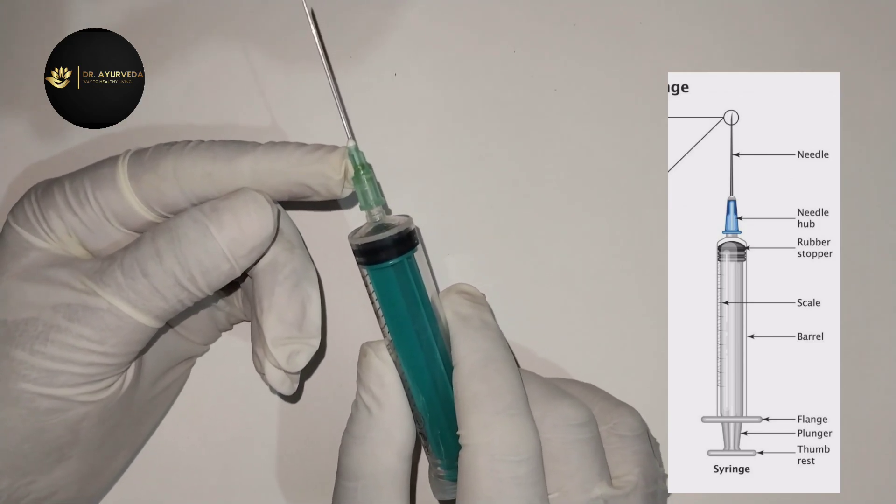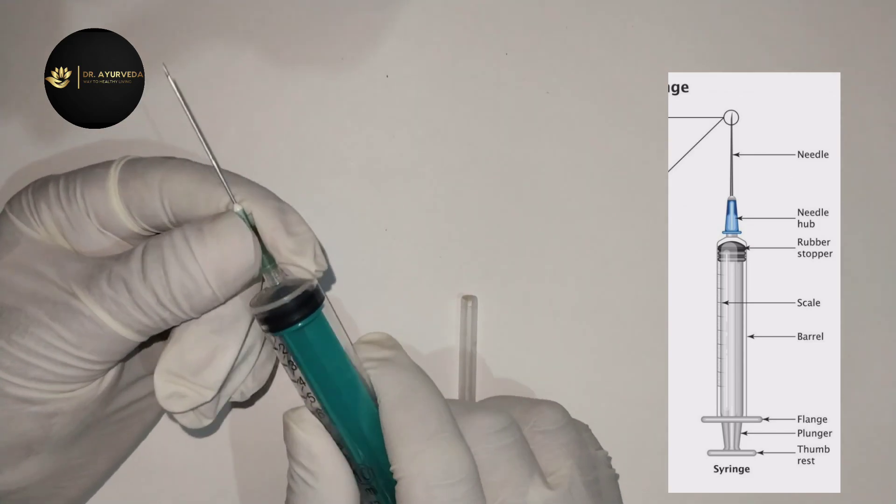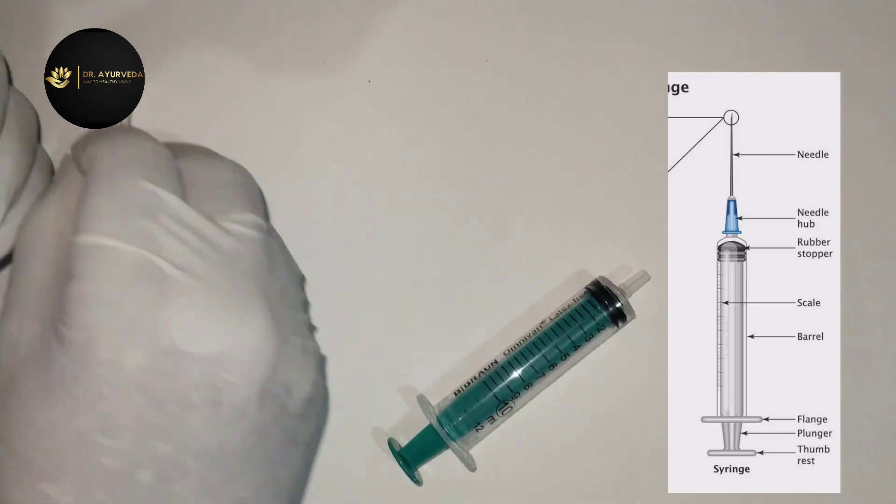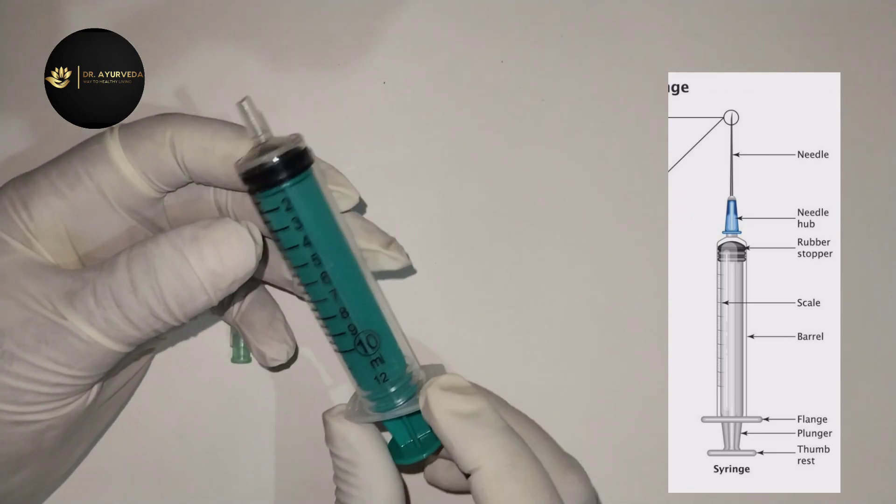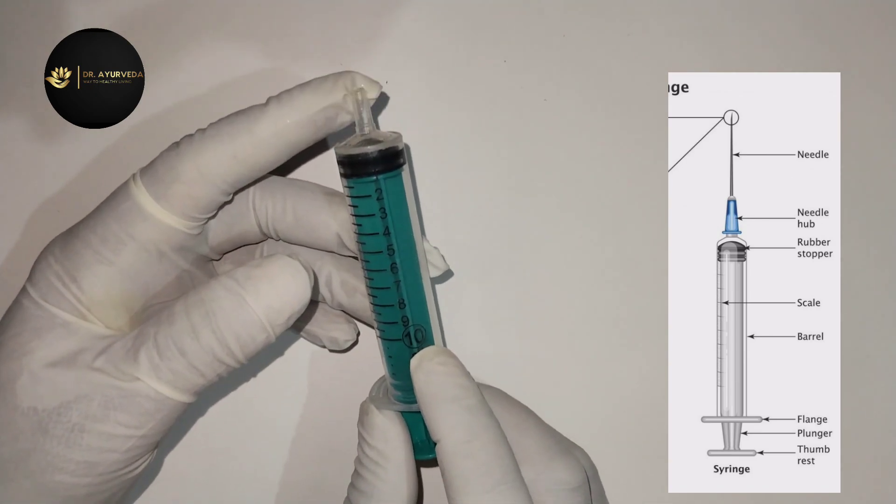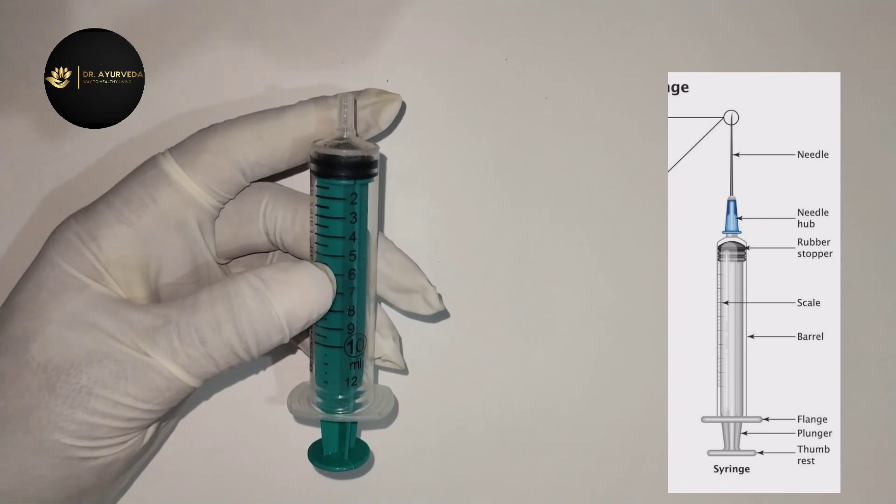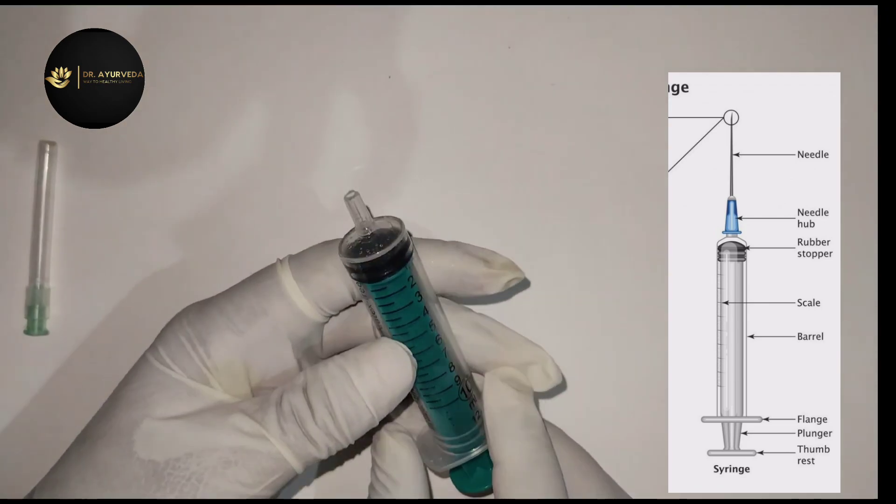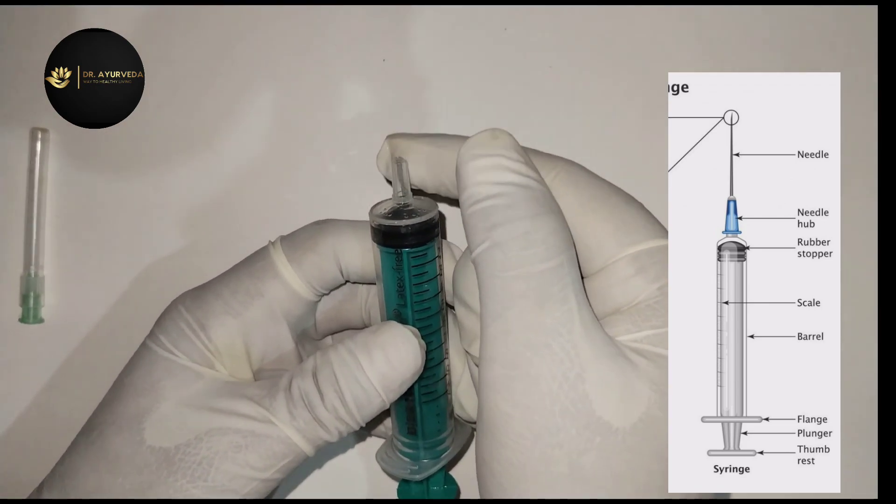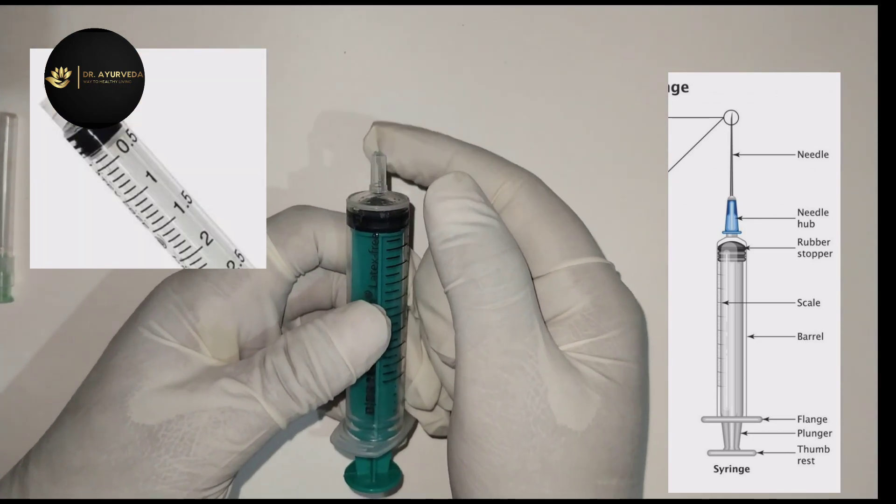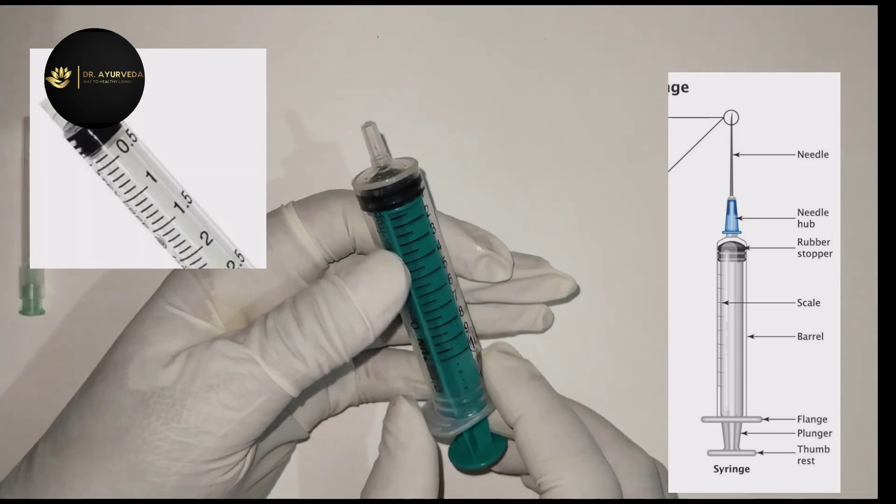The needle hub is the part which is the adapter. Here is the cap, here is the needle, and this area is the tip.